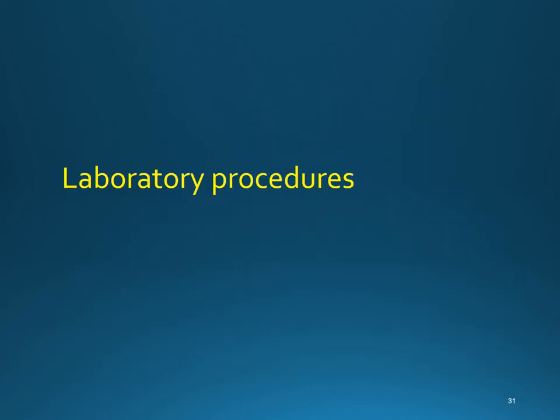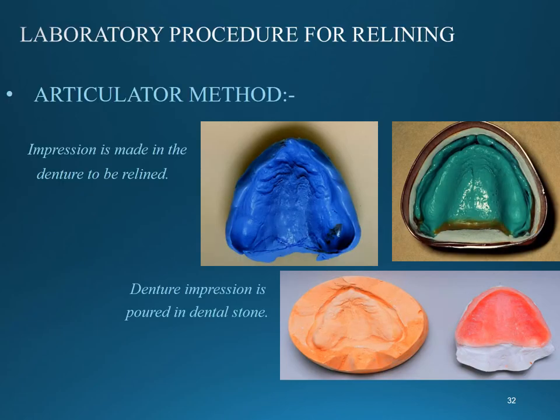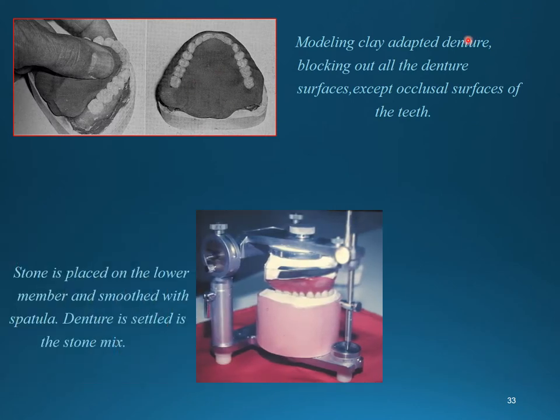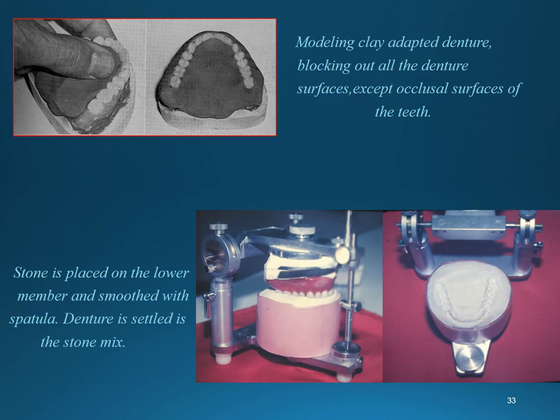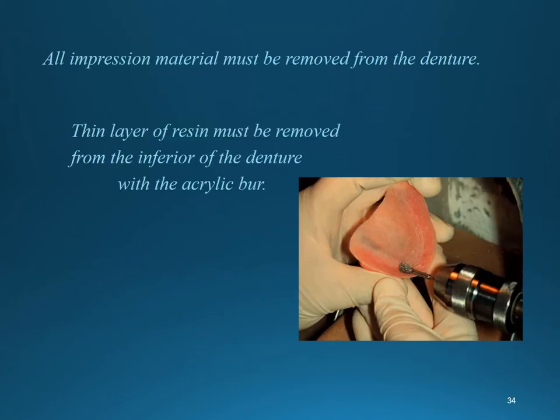Coming to the lab procedures — the articulator method: an impression is made in the denture to be relined and poured in dental stone. Modeling clay is then adapted to block out the denture undercuts everywhere except the teeth. Stone is placed on the lower member of the articulator and smoothed with a spatula. The dentures are settled in the stone mix. All impression materials must be removed from the denture.